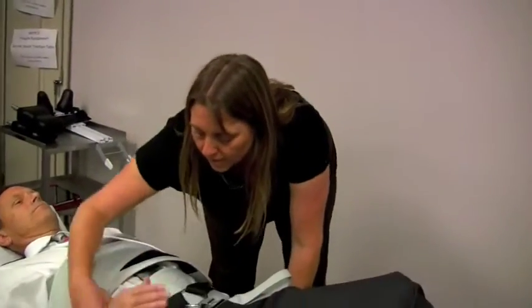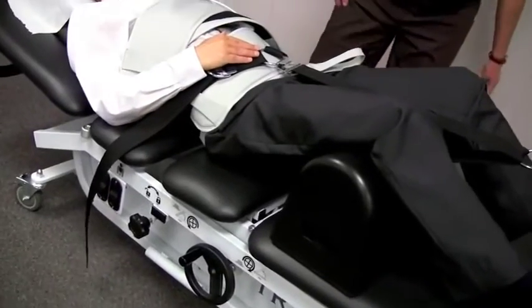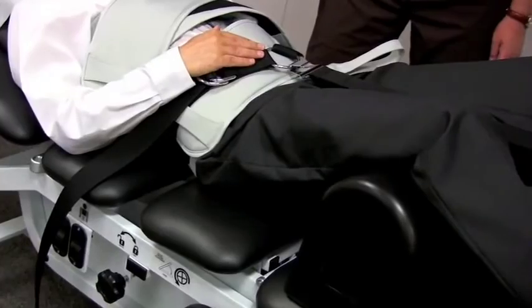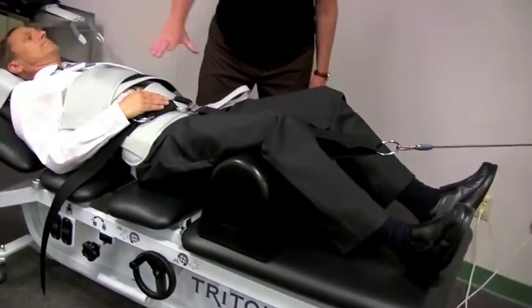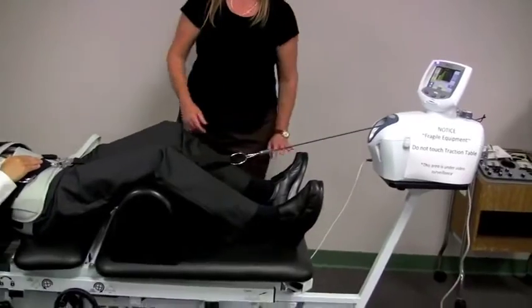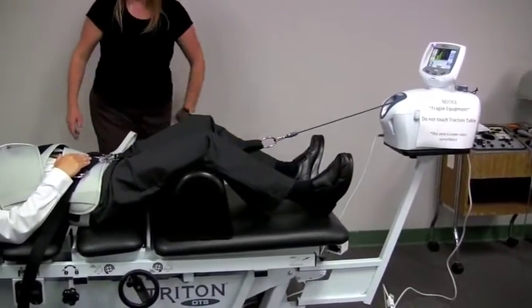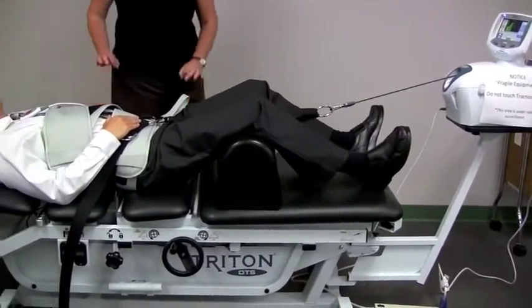Now, what's fun is, right here, we can see that this is opened up. Now, one of the things I didn't do is raise the table. I could probably have raised the table just a little bit more. You'll feel a little bit more tension when I do this. Yeah? Is it okay? You want the body to be kind of equivalent in height with the rope. So the rope kind of has an axial traction. Right there I was doing more of a traction to cause a little bit of a flexion or posterior pelvic tilt. Are you comfortable? Yes. Great.